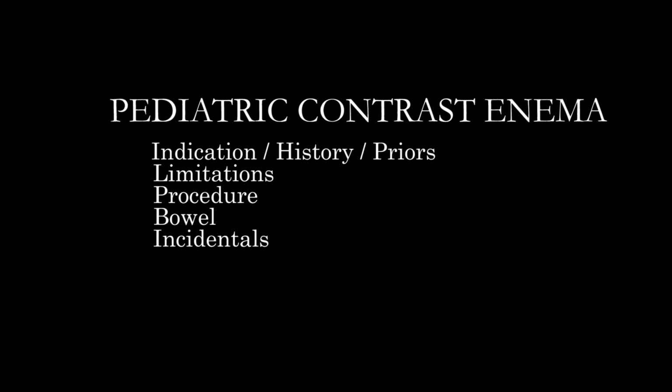Anatomic abnormalities are going to be apparent clinically before the patient even reaches you. But take a look at that and at any extrinsic or intrinsic bowel abnormalities as you instill the contrast, keep an eye out for any other incidentals, and understand the role of this sort of exam in the potential diagnosis or in suggesting etiology such as Hirschsprung's disease.